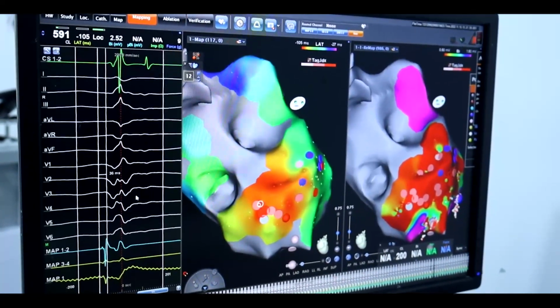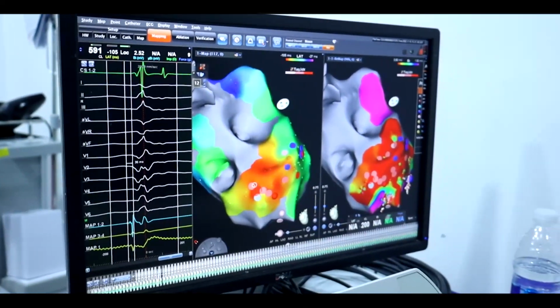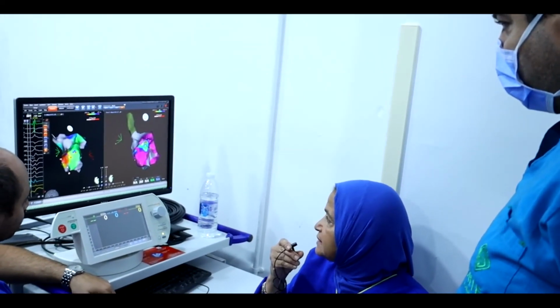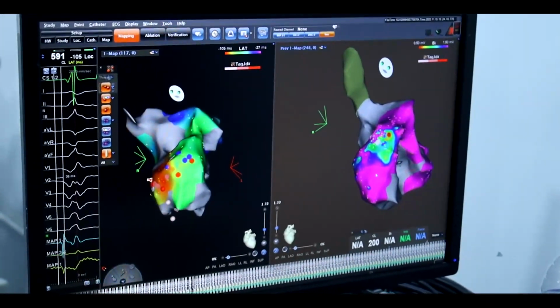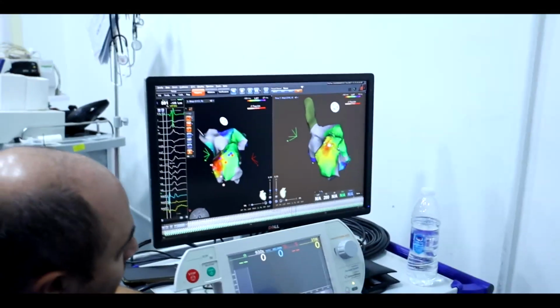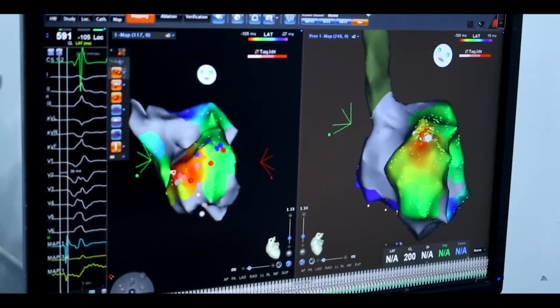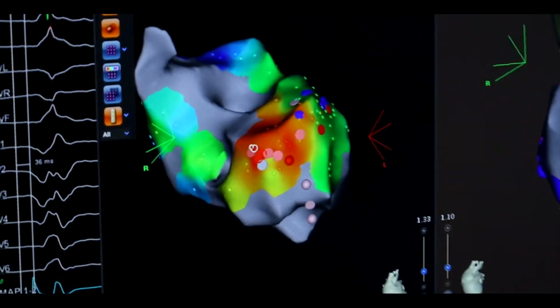You waited 40 minutes and there is no recurrence, and you did a VT study to see if there is any hidden VT. Can you go to the first study which was done a month ago? We did a voltage map and we saw that this is the area of low voltage, the green-blue one Khaled is pointing at. We got early potential before the PVC and we ablated. Yes, this is almost the same area, the first ablation trial.